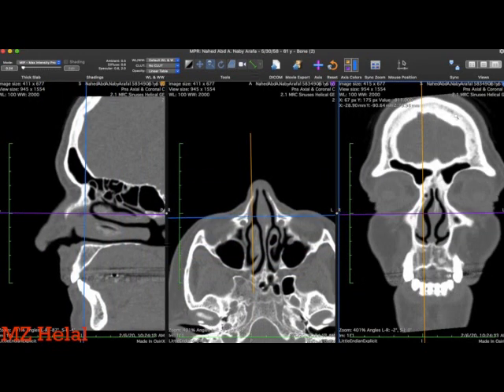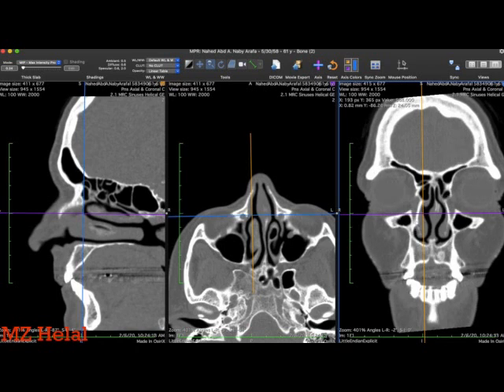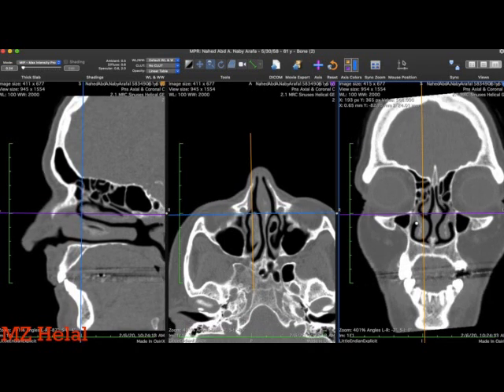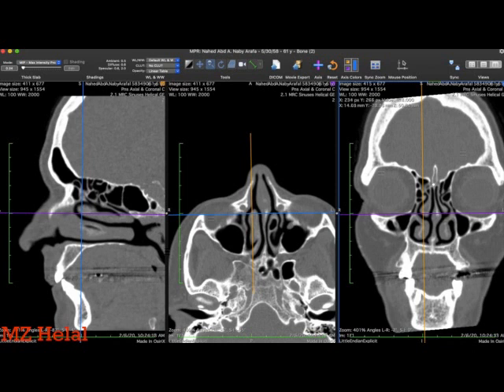She has CSF leakage on her right side. She got some deviated septum on the left in the preturbinate area, and then we go back examining the frontal sinus, the frontal recess, and now we are at the start of the cribriform plate here.